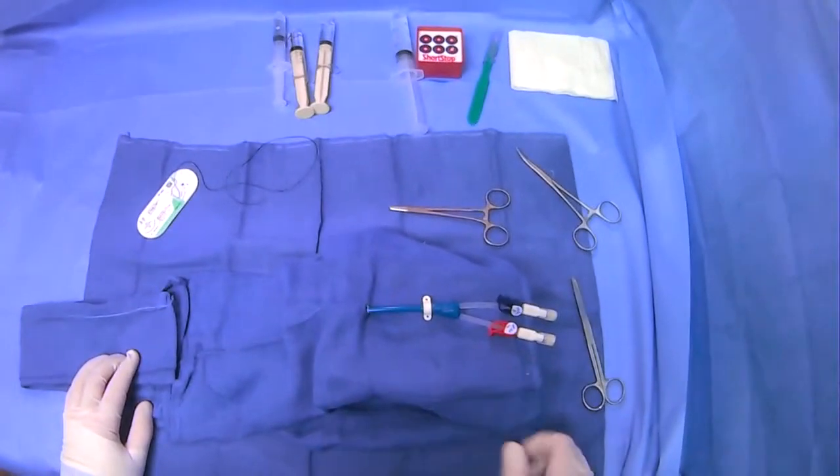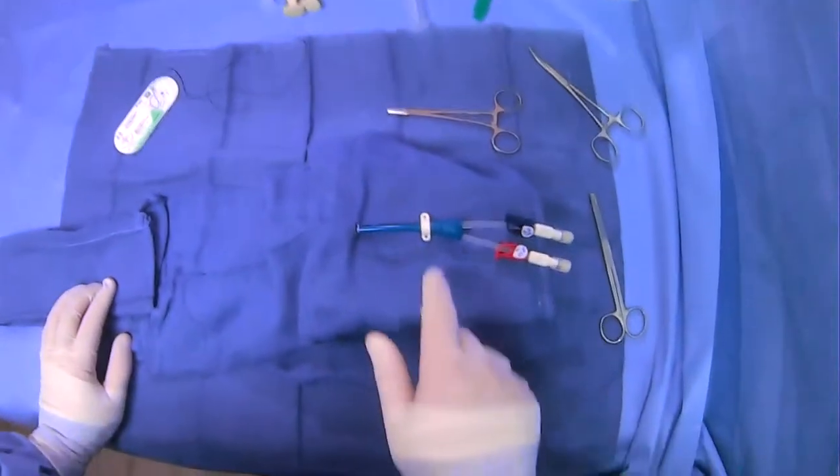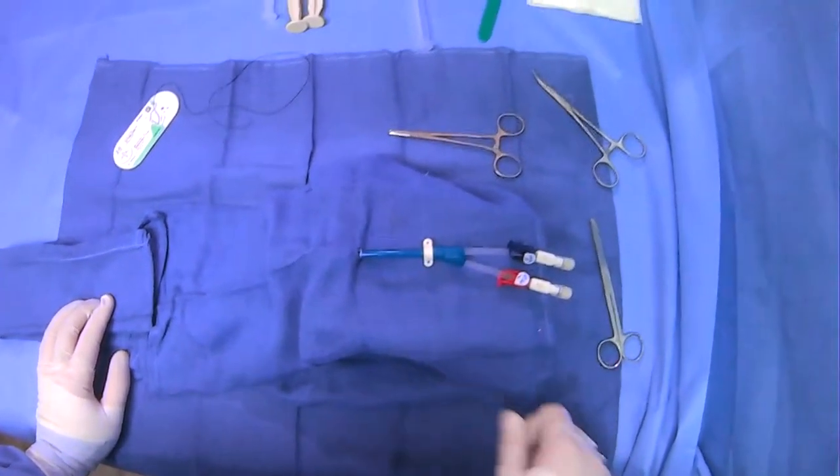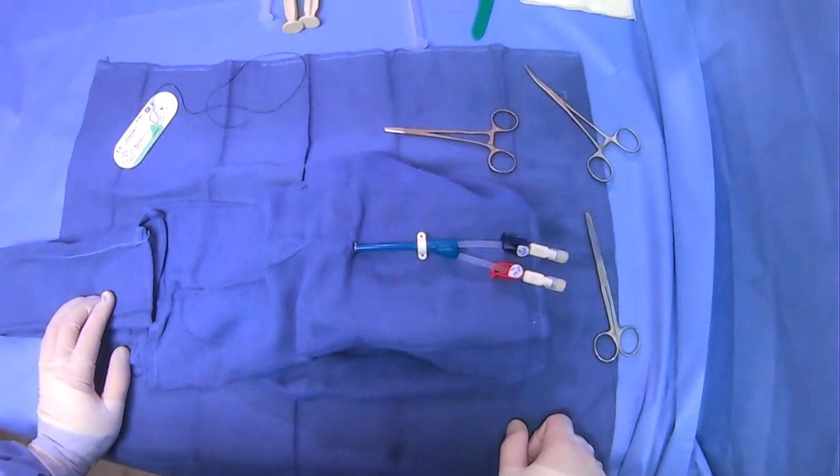I want to show you a different technique for securing this catheter in place, using the provided areas here.